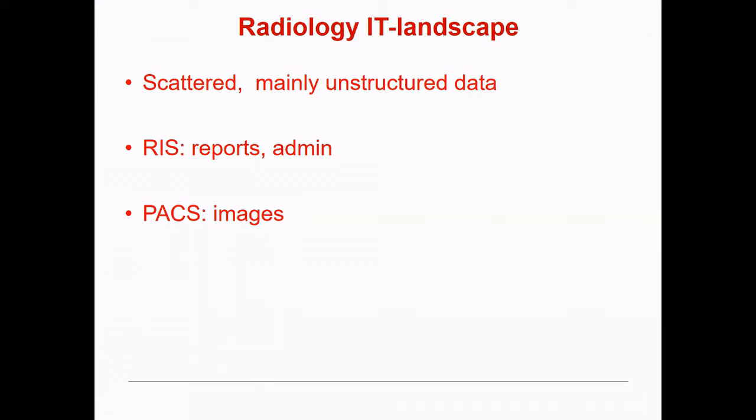And then when you read it as a doctor, whatever Word file you create gets saved in the radiological information system. So already there you have a little bit of a scattering of the data. And then these reports, I had to learn this as well: if you don't create a flat text, but say, okay, this is the introduction, and this is this body part and that body part, in medicine, people think this is already a structured report, although it's still a flat text.